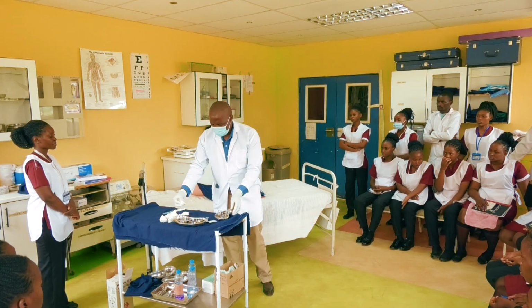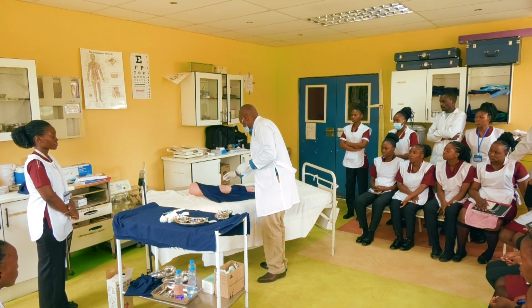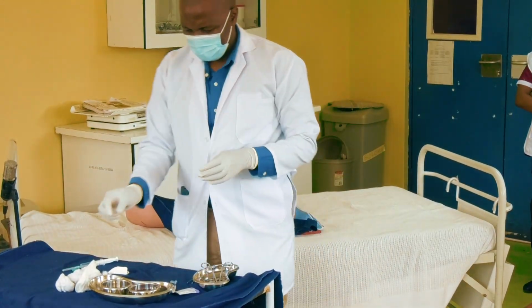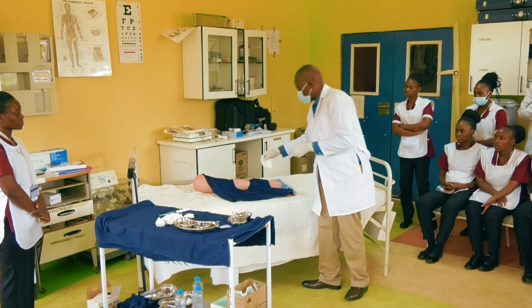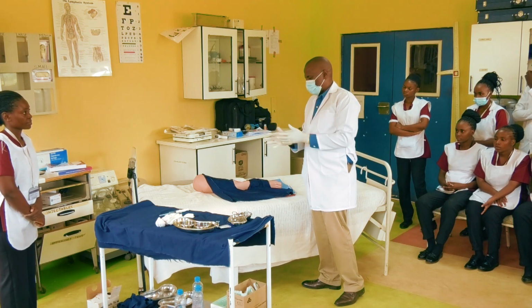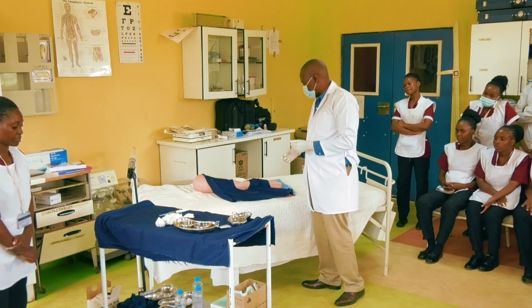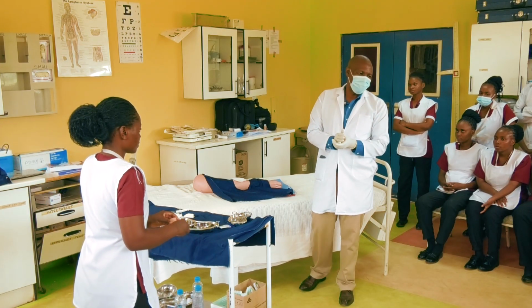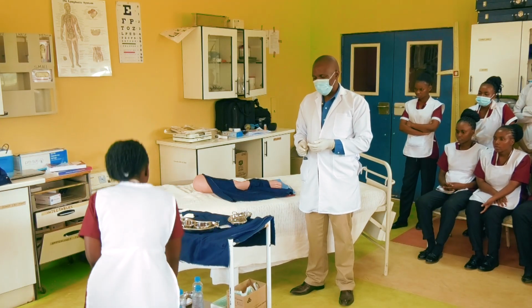Then I can get another swab, dip it in the solution that we are using, and just clean around, right? Do the cleaning. Once the cleaning is done, get a dry swab. That's according to your procedure manual, okay? A dry swab, put it there. Strapping is there. As I was doing this, I would have even asked my assistant, just give me some strapping. So strapping ready, you strap, then the dismantling procedure, I think it's something that we know. Do you have any questions? You have scissors there.